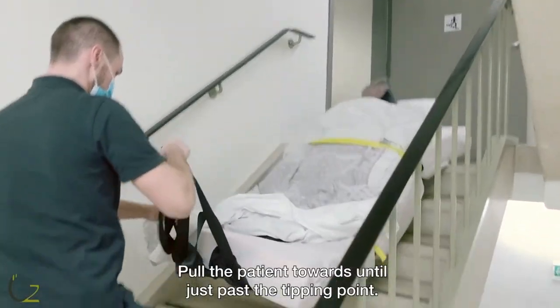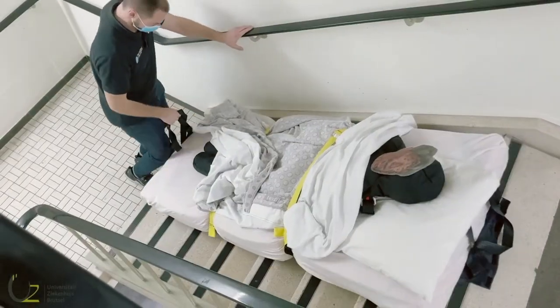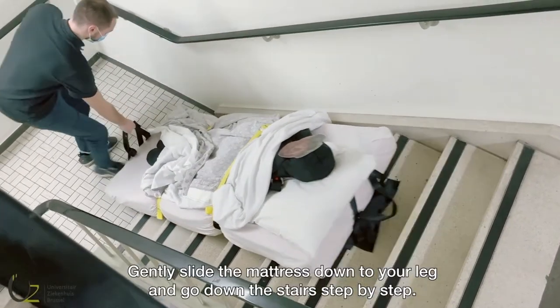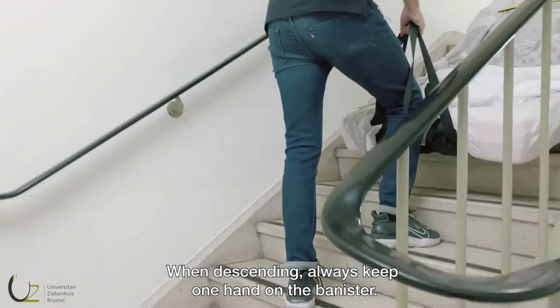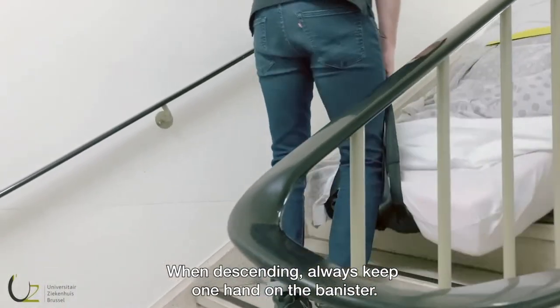Pull the patient towards you until just past the tipping point. Gently slide the mattress down to your leg and go down the stairs step by step. When descending, always keep one hand on the banister.